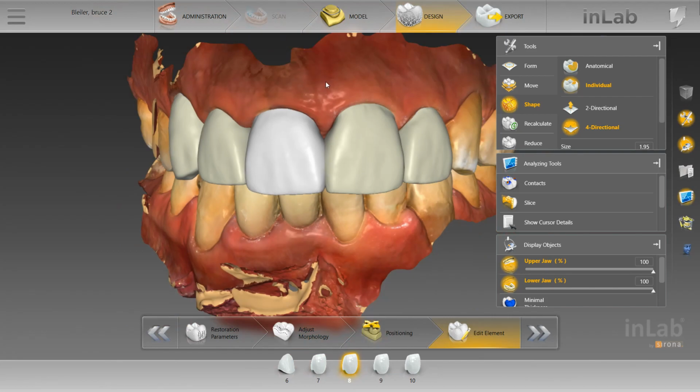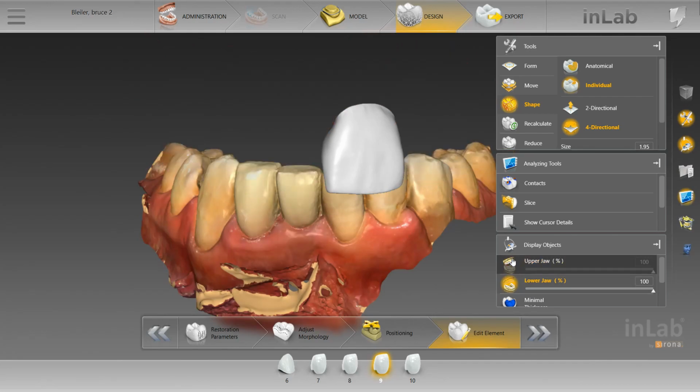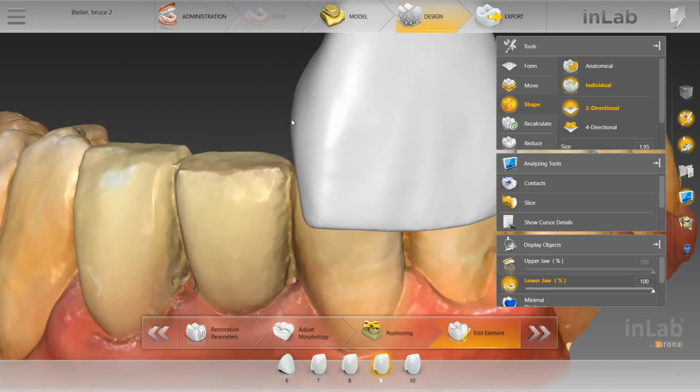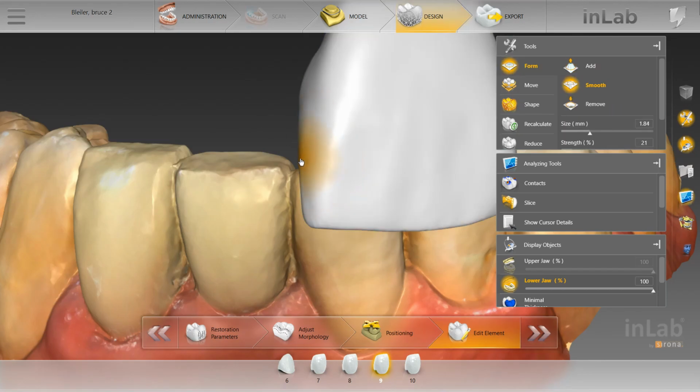So we want to basically go perpendicular from that occlusal plane. And how we're going to get good contacts, we don't need to take away the lower, but take away the upper. And if you take away the upper, you can see that this isn't perpendicular. There would be an angle, if you were to draw an angle of the occlusal plane with this. So what we're going to do is take the 2-directional, and to start this out, we're just going to make this straight. Grab it and make it straight, to where it'd be, say, perpendicular. Then we'll grab the smooth tool and just do a little touch-ups.